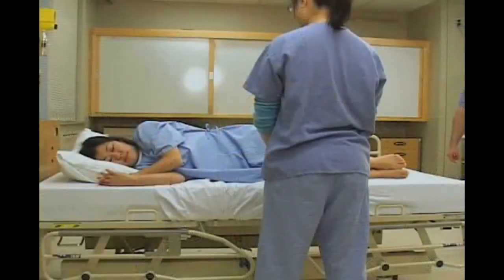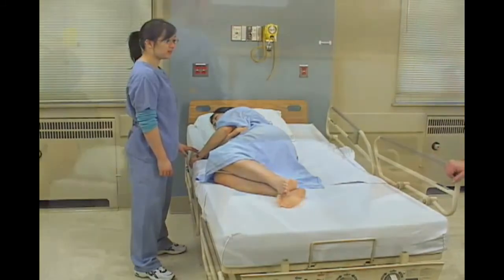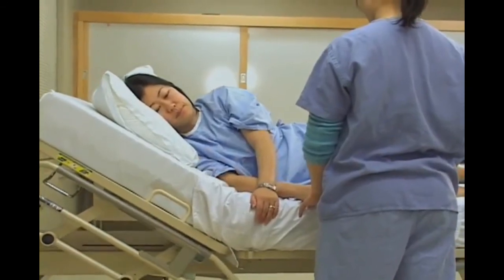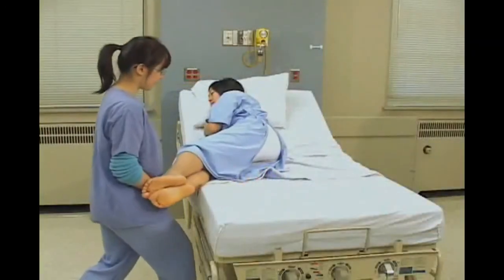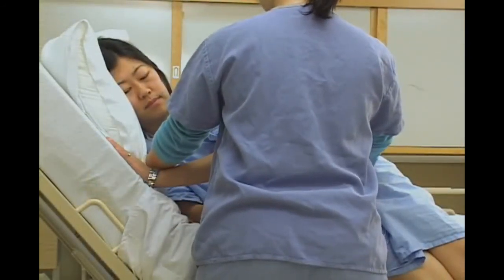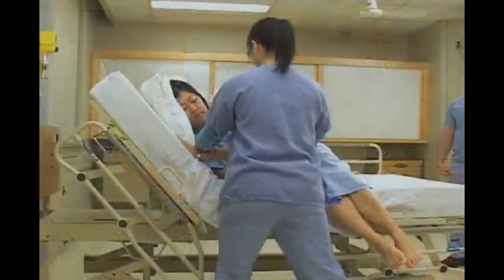Before assisting the patient from lying to sitting, position her close to the edge of the bed and turn her on her side with her knees bent. Explain the procedure and ask the patient to help if possible. Ensure the bed brakes are locked. Adjust the bed height to the upper thigh level of the shortest caregiver and raise the head of the bed to approximately 45 degrees. If the patient has hip or abdominal discomfort, reduce the inclination. Bring the patient's legs over the edge of the bed using a front-to-back weight shift. If needed, lower the patient's legs against the caregiver's thigh to reduce stress on her hips. Then raise the head of the bed as much as possible, and stand between the shoulders and hips of the patient, placing one hand on the hip and the other behind the shoulder in a side-to-side weight shift position. On the designated count, perform a side-to-side weight shift.